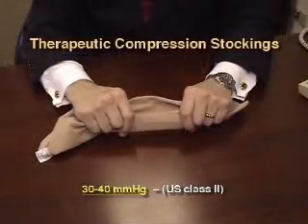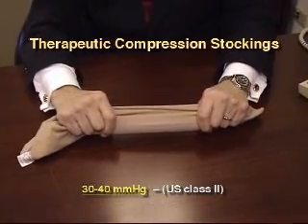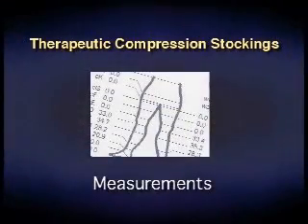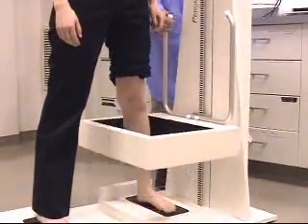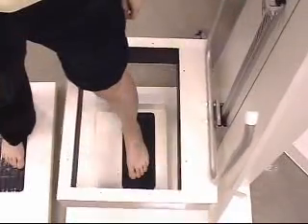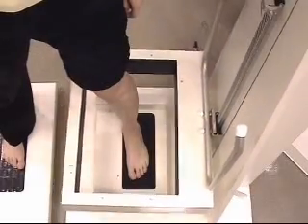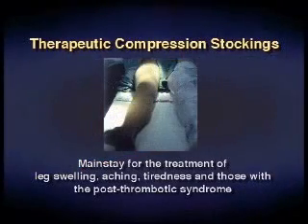The next level of stocking is the Class II product, which delivers 30 to 40 millimeters of pressure at the ankle. One other variable in determining the ankle pressure is the size of the leg. A medium leg is usually associated with the advertised pressure, and other size legs may be associated with slightly different pressures. I personally use this class of stocking for a wide variety of mild to moderate venous disorders. It is very effective in relieving the symptoms of mild venous insufficiency and correcting mild or moderate edema.